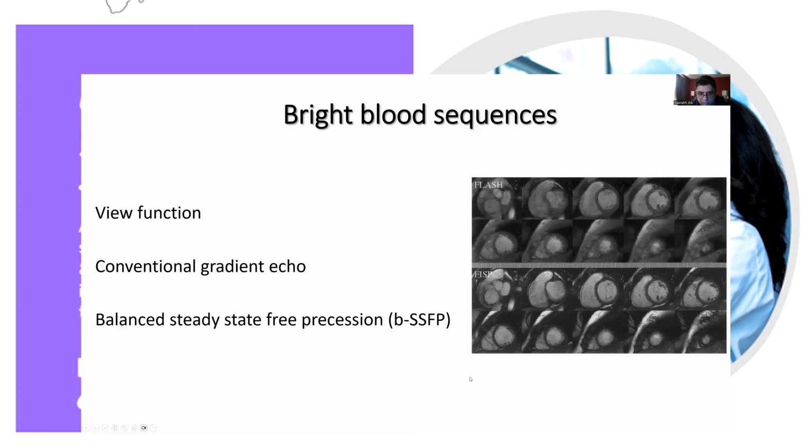So I spoke about one sort of imaging, which we can broadly call dark blood imaging. Another type of imaging is bright blood imaging. Just as in dark blood imaging, the angiographic contrast is because of the flow of blood, so it is in gradient echo imaging, or bright blood imaging, where flow makes the blood bright. Why is it so different?